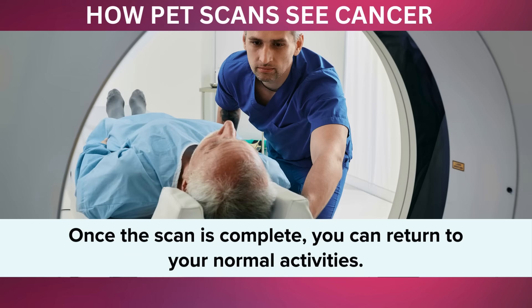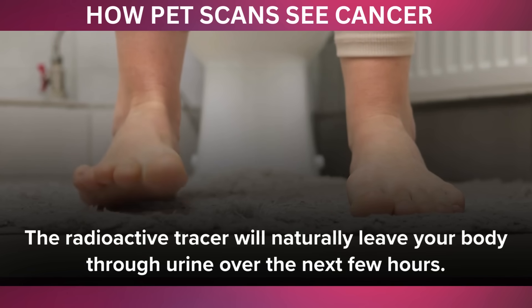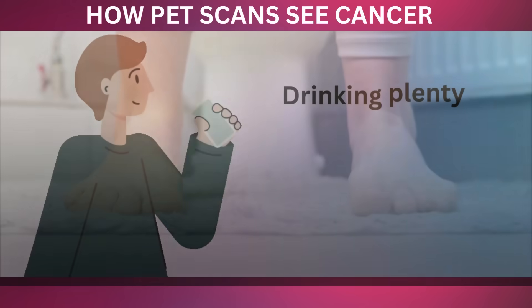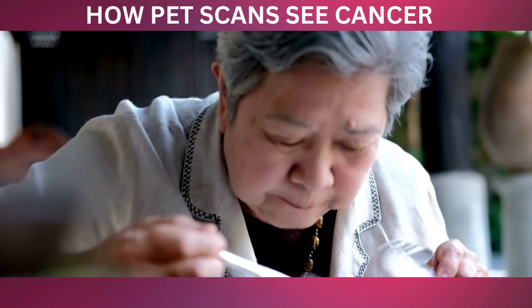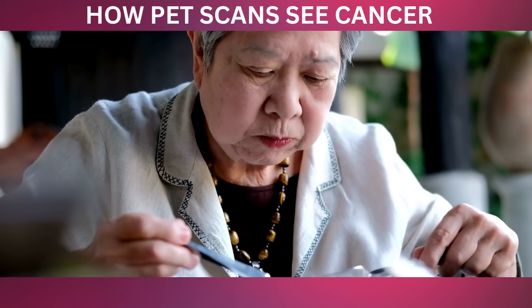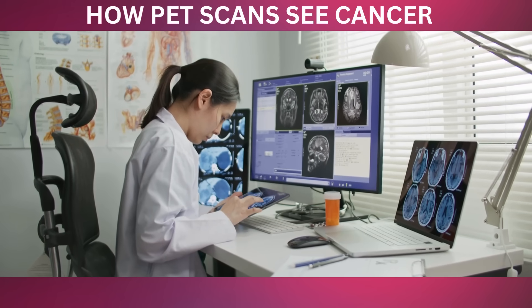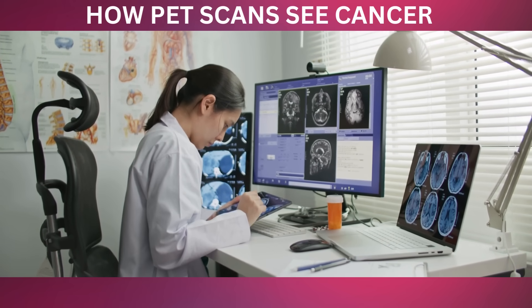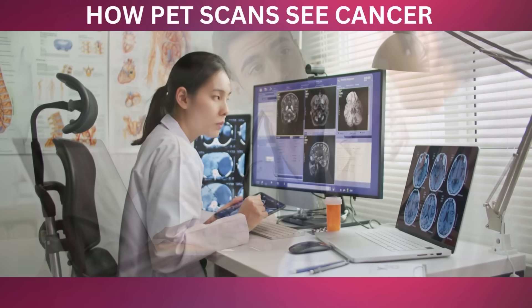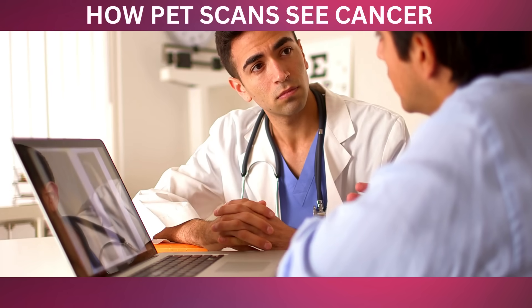Once the scan is complete, you can return to your normal activities. The radioactive tracer will naturally leave your body through urine over the next few hours. Drinking plenty of water can help speed up this process. There are typically no side effects, and you'll be able to eat and drink as usual. The images produced by the PET scan are reviewed by a radiologist, who will interpret the results and send a report to your doctor, who will then discuss the findings with you and explain any next steps.